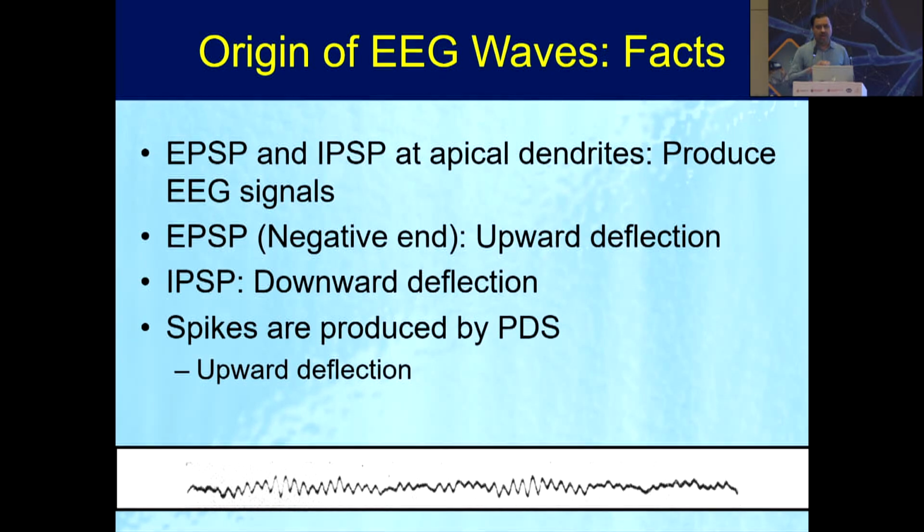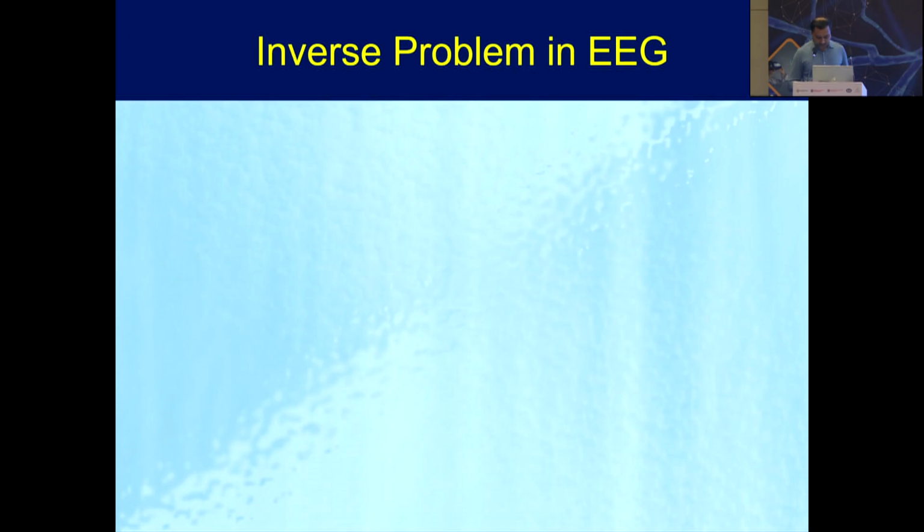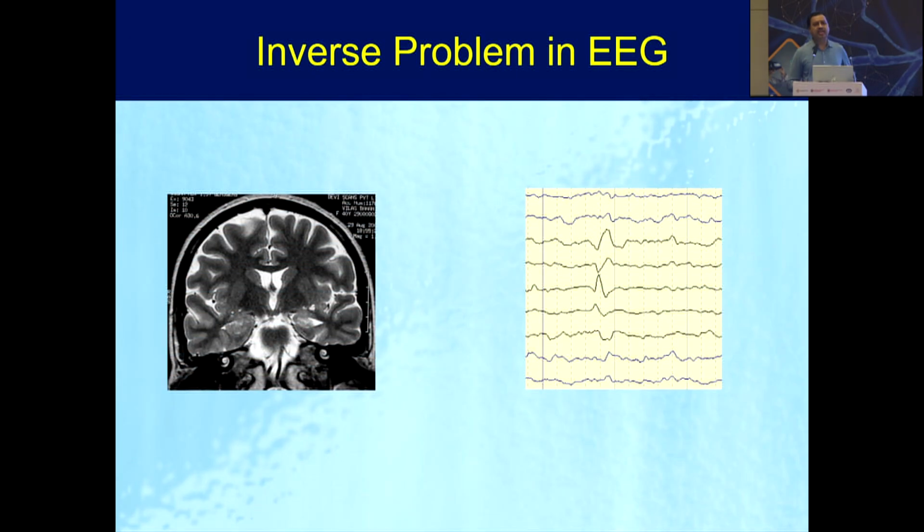And what we look at in the EEG waveform is what we finally see, initially in the analog EEG and now in the digital EEG. One thing we need to understand is about these EEG waveforms or signals which are produced. Basically, what we do while reading the EEG is, let us say, we have an EEG waveform with this spike on the left temporal lobe.